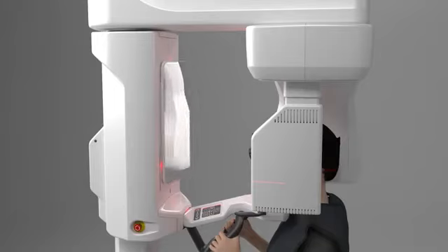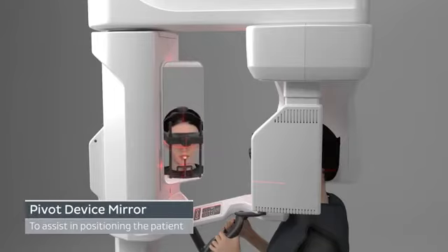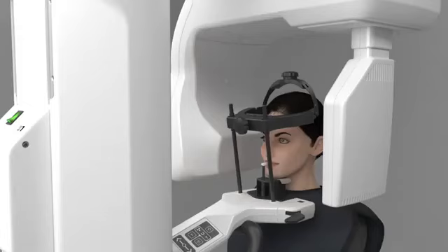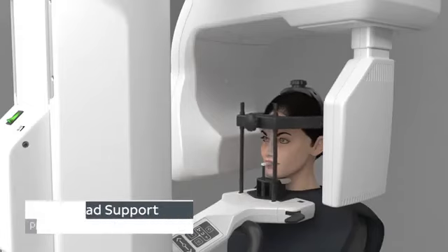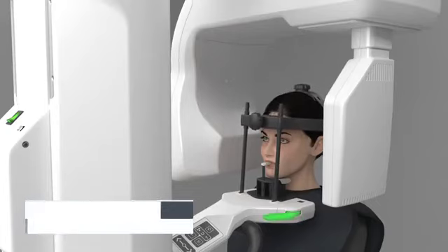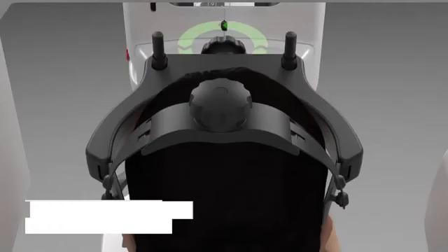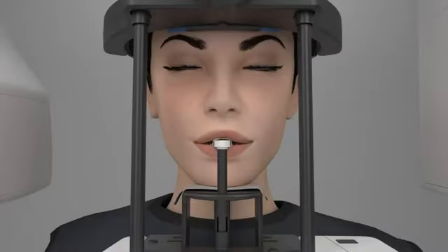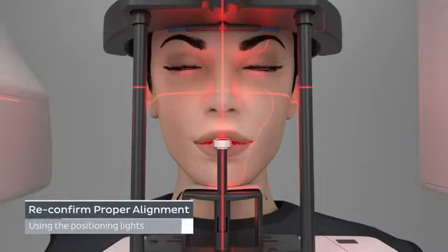You can open the mirror and use it to assist in positioning the patient. Close the mirror before you start acquiring an image. Move the head support against the patient's forehead. Adjust the height of the head support if needed. When complete, lock the head support using the locking lever. Adjust the temple supports using the adjustment knob. Reconfirm proper patient alignment using the positioning lights.